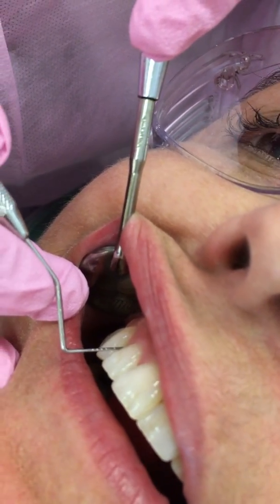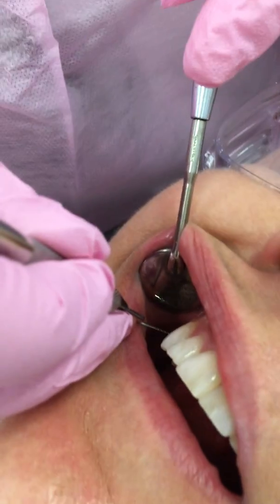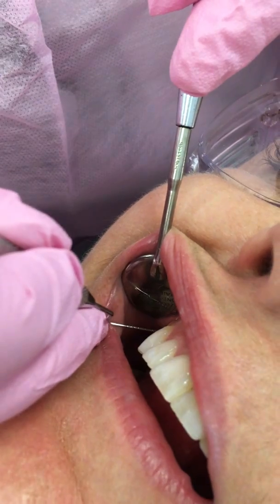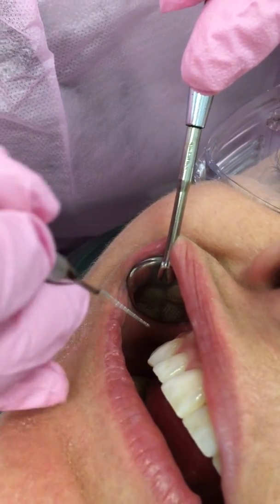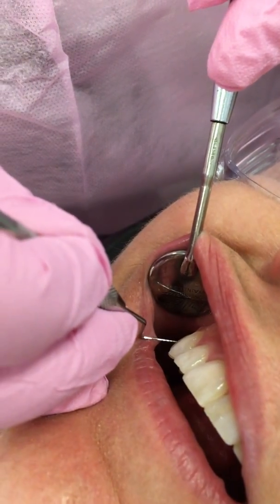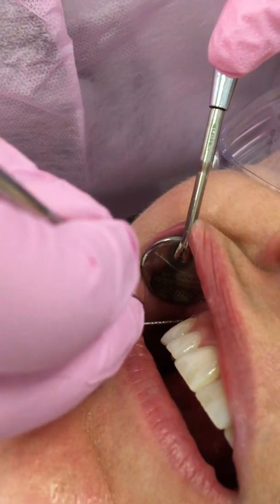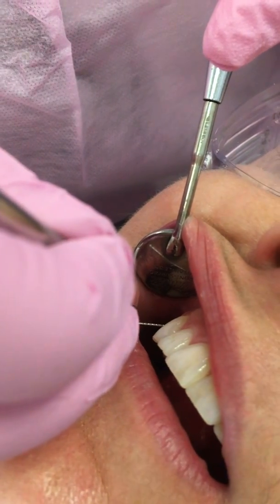Because if I go here, I've missed all this in here. All right? So I'm going to walk it, and then I'm going to go into the distal of the tooth in front. And this tooth is an implant, so I'm going to skip it. They do have implant probes, which I don't have in my setup. So I would have looked at her record ahead of time and known that she had an implant, and I would have been prepared with some implant instruments.